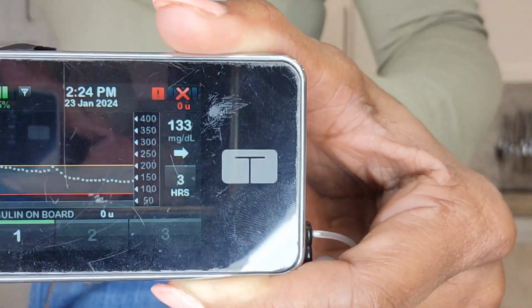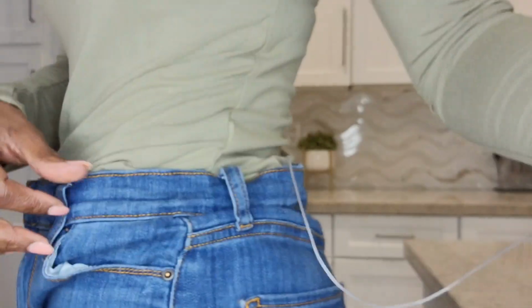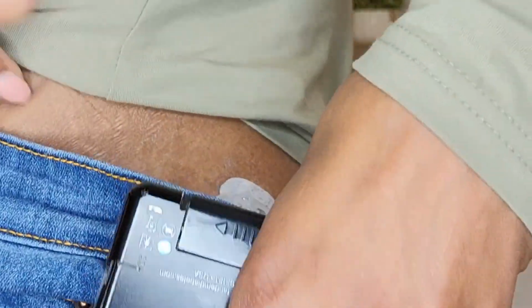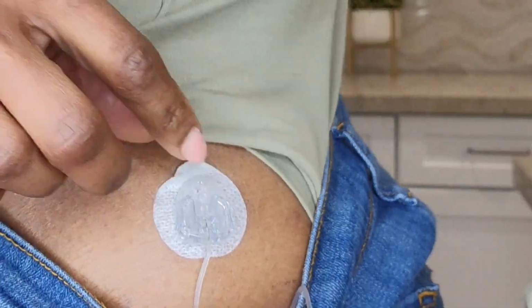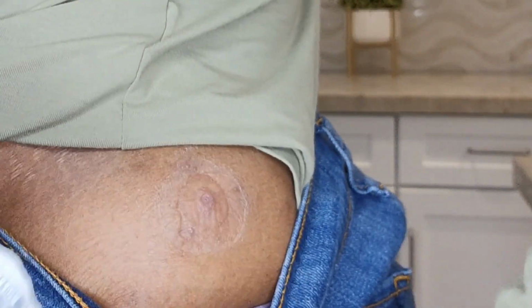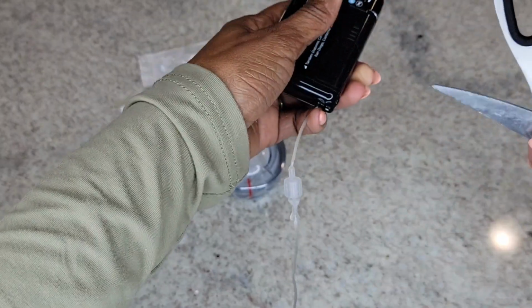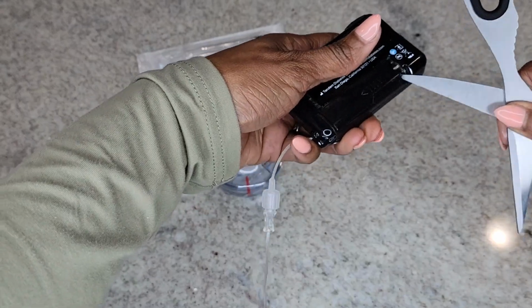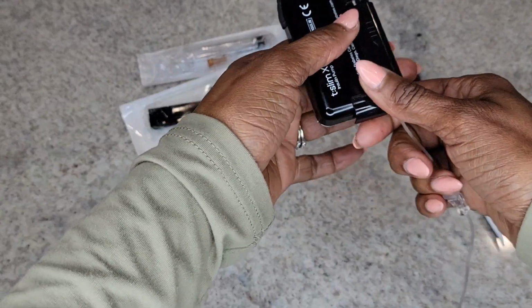I'm currently on the Tandem T-Slim X2 pump and I insert it at the hip. So the first thing I have to do is remove the old infusion set so that I can put a new one on. So you just yank that off just like that. Sometimes it hurts, sometimes it doesn't. This one didn't hurt too bad. I'm gonna start changing it out by removing the old reservoir set. And I'm using scissors because frankly, I ain't trying to break no nails.